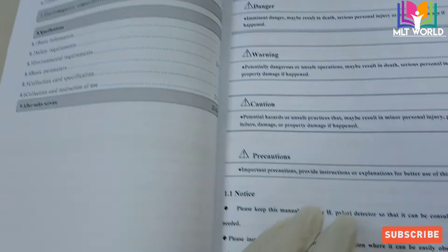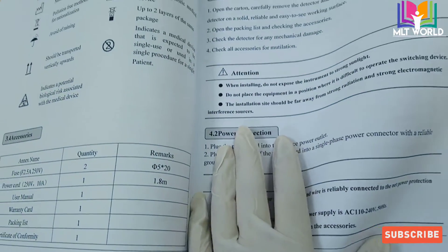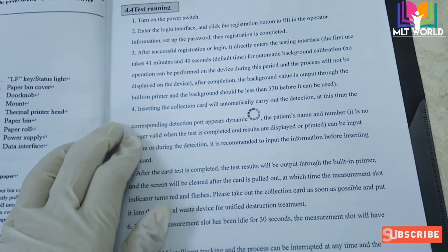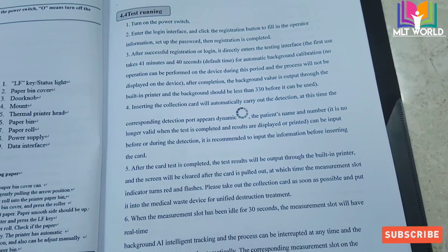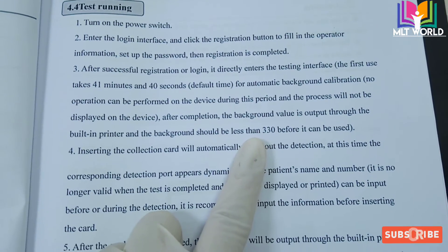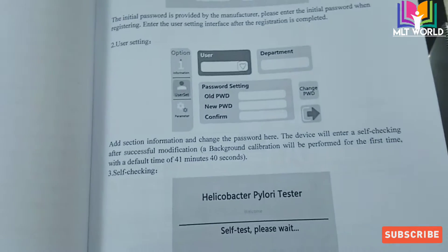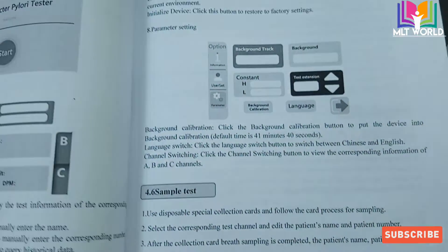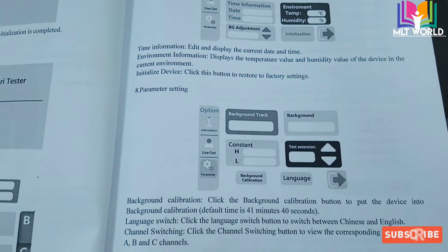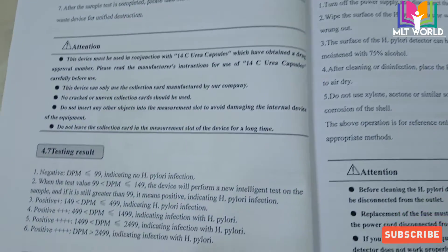This is the manual that comes with the machine. Your supplier will provide this manual, and it contains all details related to the machine — available parts and the procedure. For example, it states the background should be less than 330. If background is more than 330, we go to the menu option and click calibration again. The machine will then redo calibration. The manual also covers how to proceed with sample testing and how to do the reporting.